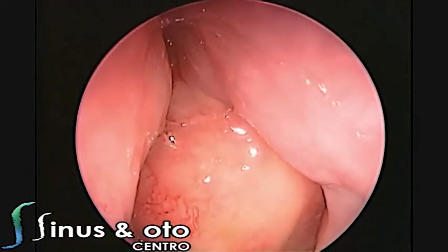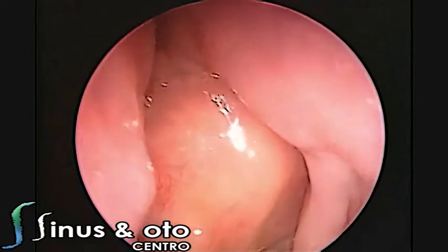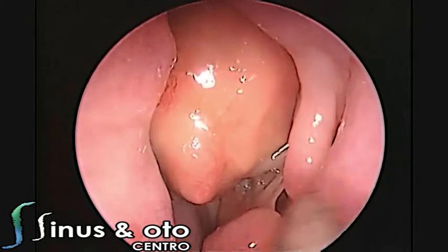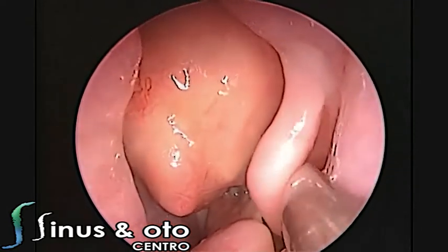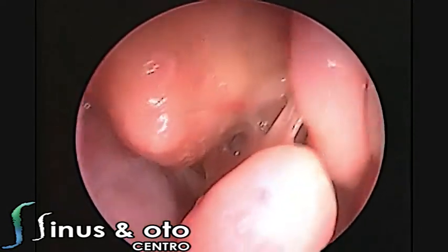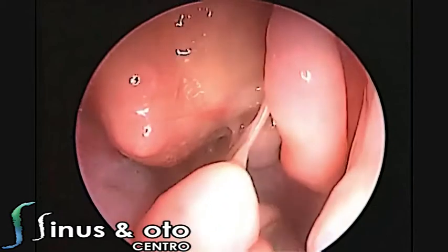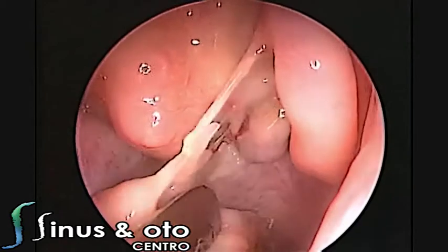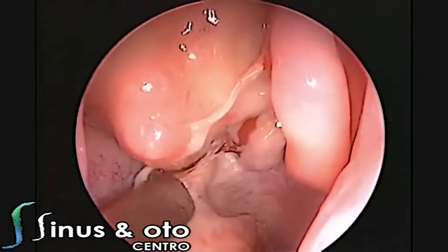This is the uncinate process on the left side. This is the upper part of the nasal cavity, and this is the uncinate process. The middle turbinate has been turned down by the lesion.